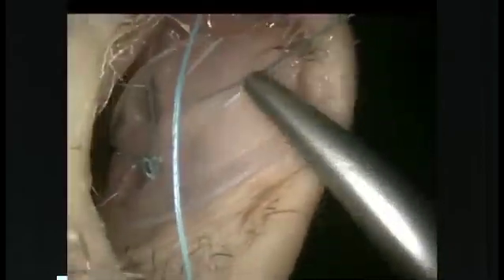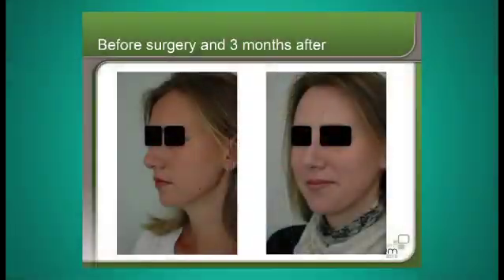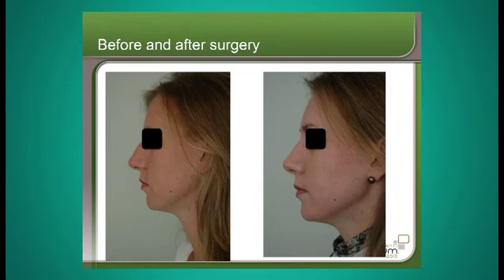So you don't really need to tie this. You put the device into position, lock it down, and when you lift the splint up and lock the suture into the splint, the cartilages become better approximated and can heal in position if you keep that for 7 to 10 days. Not a huge cosmetic change, but you get slight nasal rotation, very slight, but it's not a terrible change in procedure. We also, in this patient, did septoplasty and some bony work up top to her dorsum.